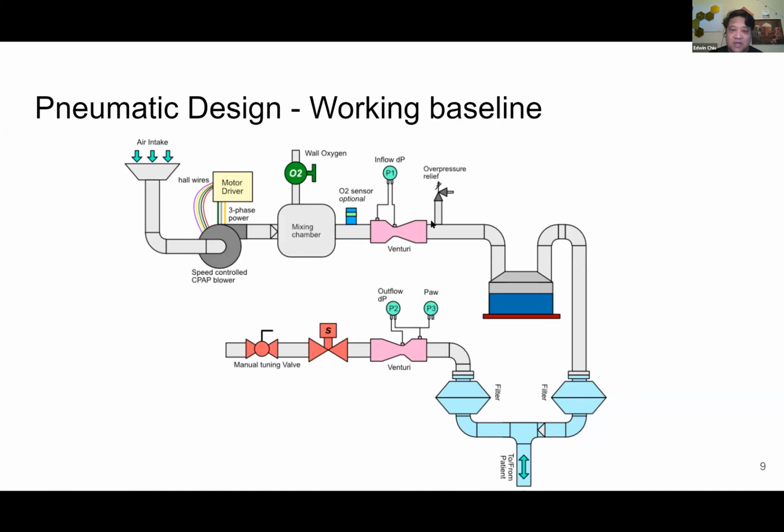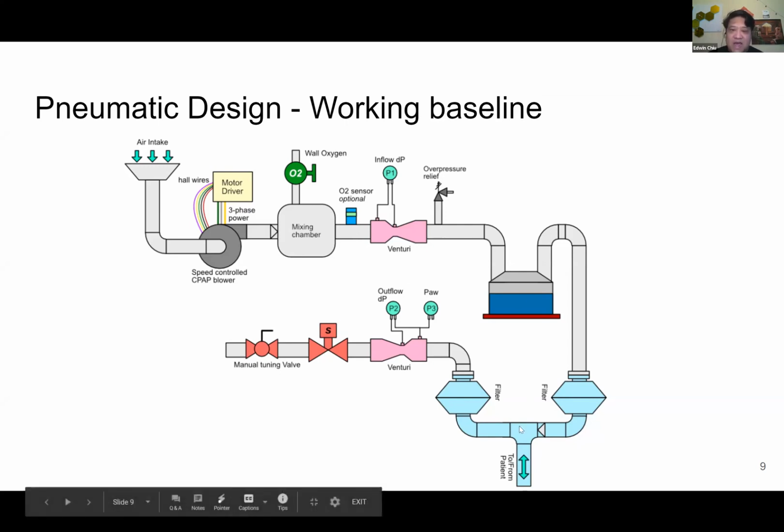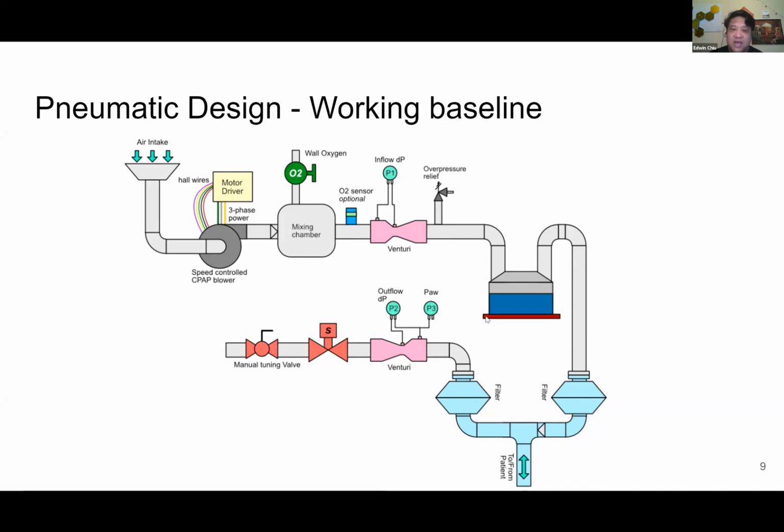We have flow sensing on the inlet and outlet side, and we take the subtraction of the two of them. We difference these to determine the amount of gas flowing into and out of the patient. There's a humidifier which heats and humidifies the air that is passed to the patient. Patients that are intubated don't have the moist sinus of the throat and the trachea, which usually performs this purpose of moistening and heating the air. So when a patient is intubated, we need to provide that. So we have a water tank with a heater, which humidifies the air.